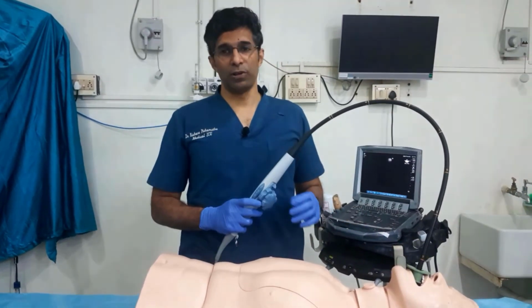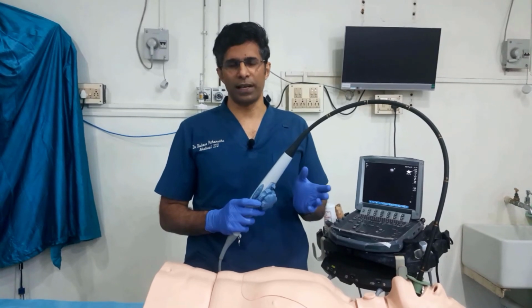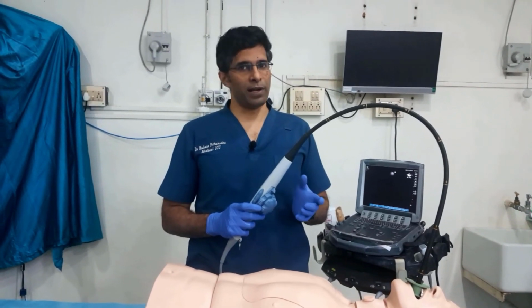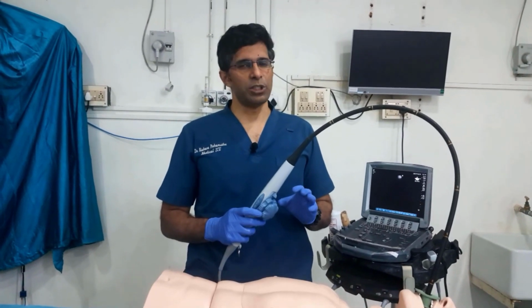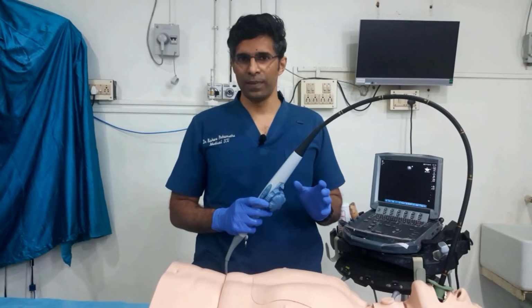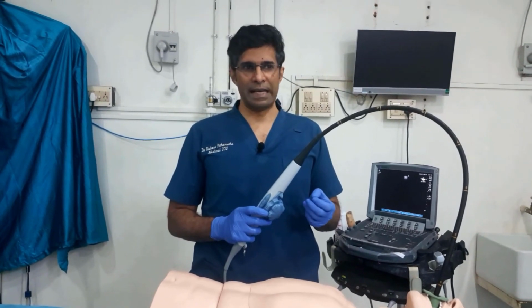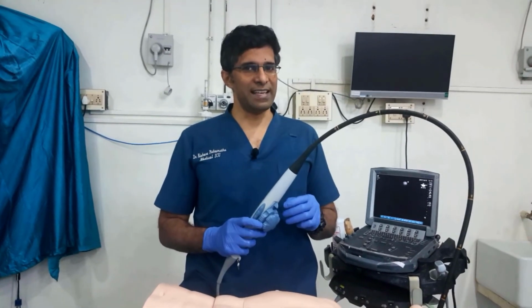Okay, so that was all the views that we showed you, just the basic views that are necessary to make a hemodynamic assessment of a patient. There are many more views, but on a day-to-day basis in the ICU, we really don't need to know all of those. So I hope that in this short time, I've been able to make it easy for you to get a handle of the basic views of TEE.